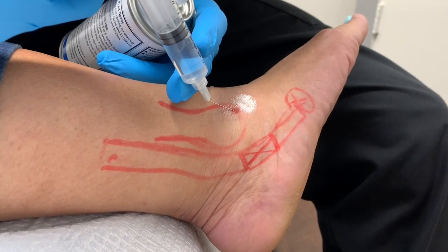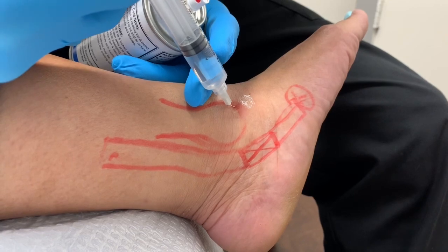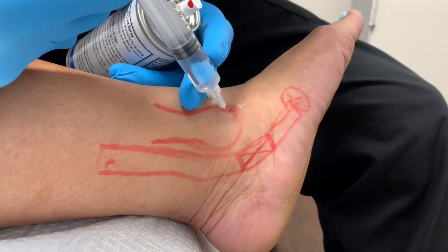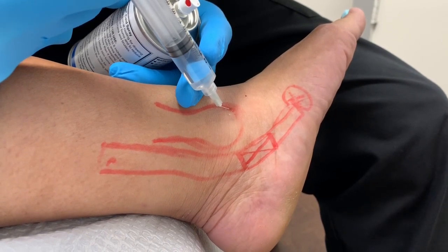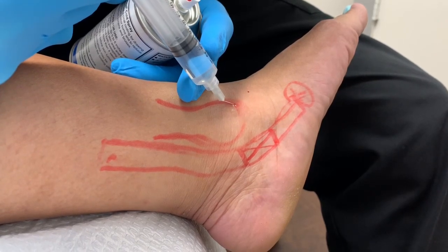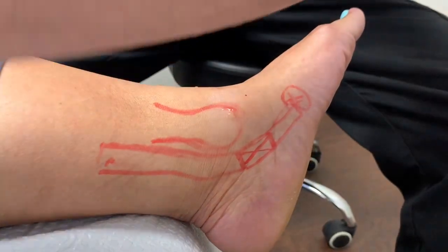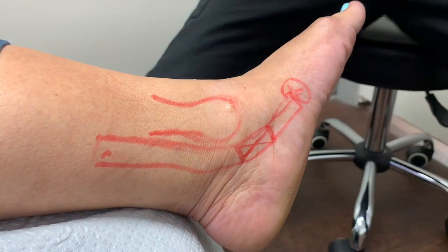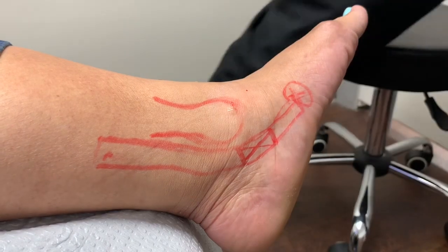Right there. And this is a little bit of a more sensitive area. She felt that. And burning now. Here we go. Okay. Yeah. And that's it. Okay, we're done. So we'll give it about a minute, and during that minute, I'll go ahead and do what I love to do, which is educate.